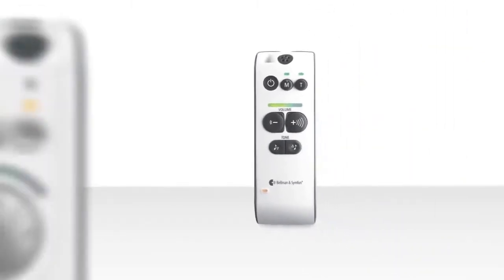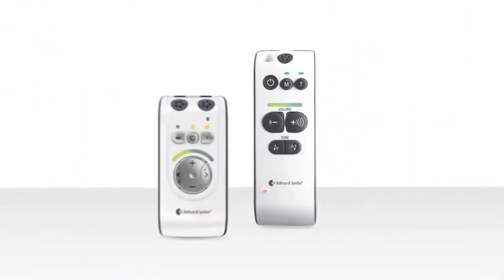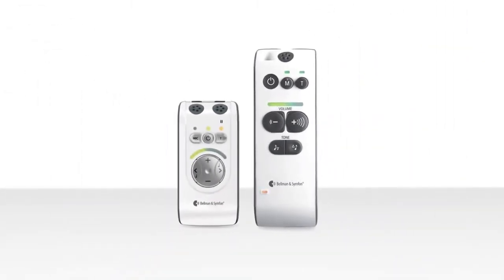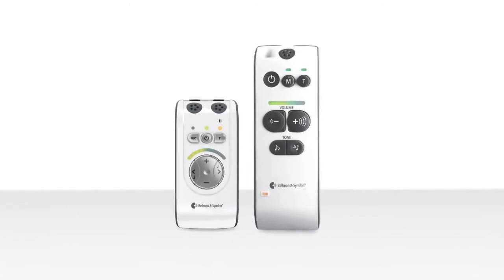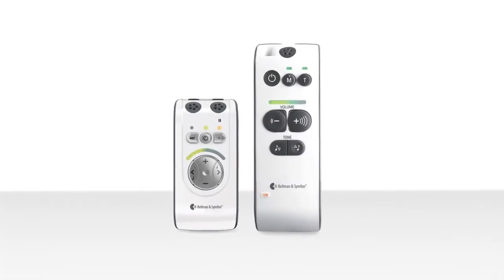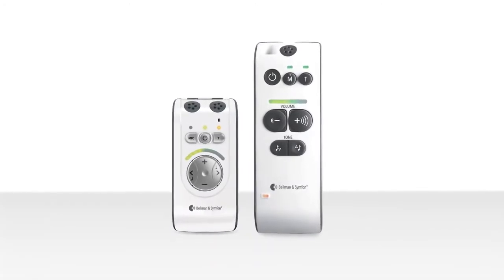The new generation of digital personal amplifiers from Bellman and Symfone delivers clear and distinct speech and works both with and without hearing aids.